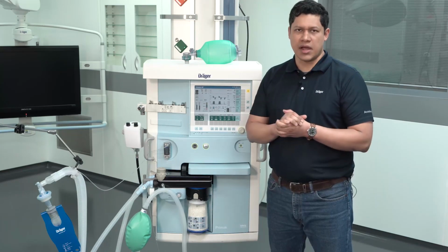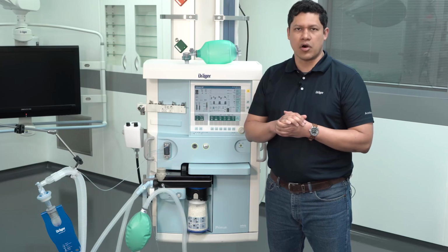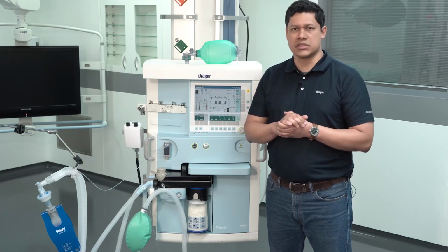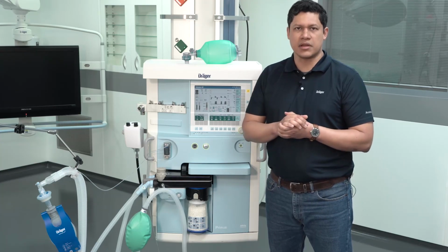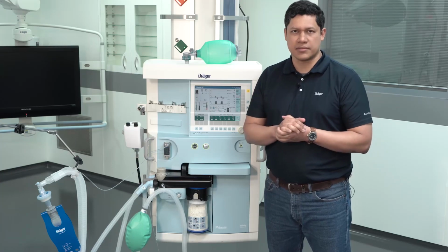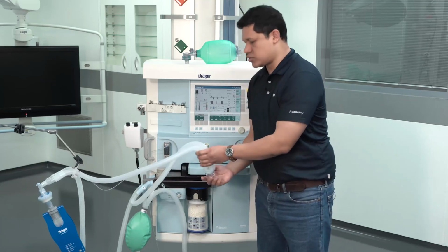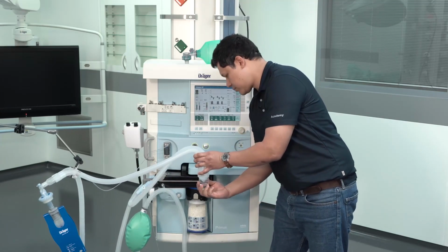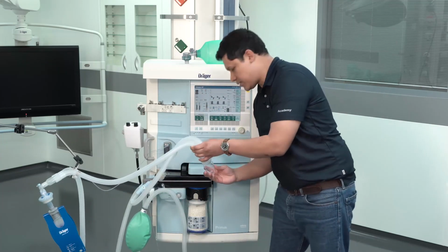Keep in mind that you have to regularly check for condensed water in the breathing hose system. The recommendation is to use a breathing hose system with water traps, because in that case you can safely drain the water and avoid leakages on the patient side. To do so, just turn the water trap and drain it. Then you put it back in its place.